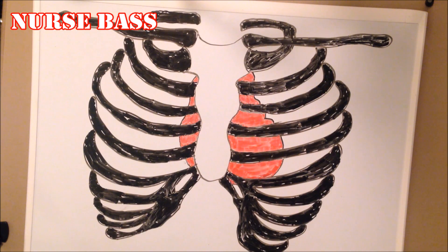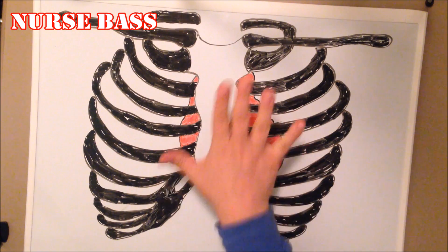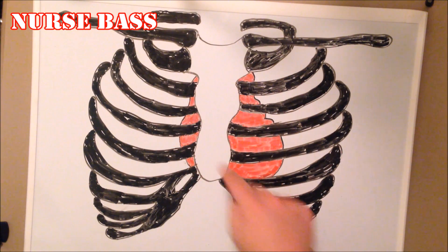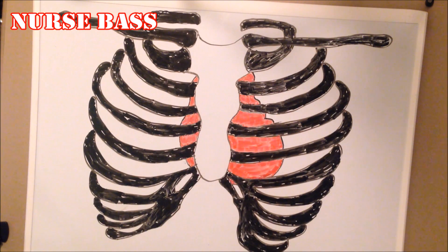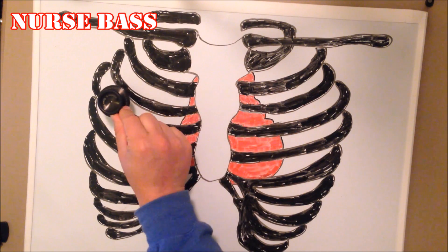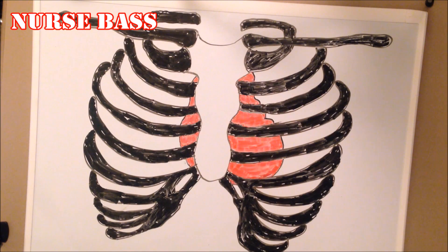For the first point — Aortic — in any nursing or cardiac assessment, you are at the right sternal border, second intercostal space. Remember, if you're looking at a patient, this is the patient's right side and that's the patient's left side. Intercostal simply means the space between the ribs — one, two — second intercostal space, right sternal border.